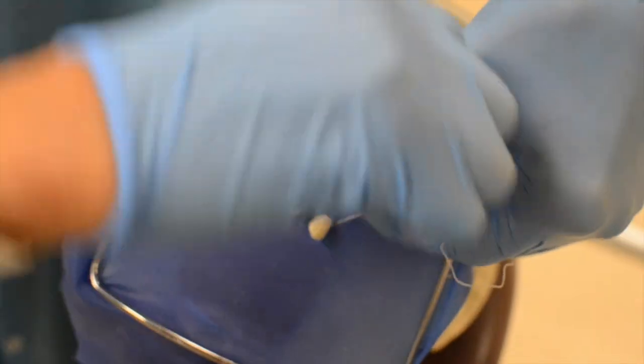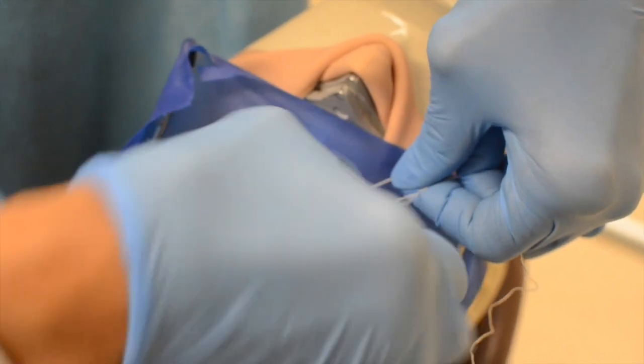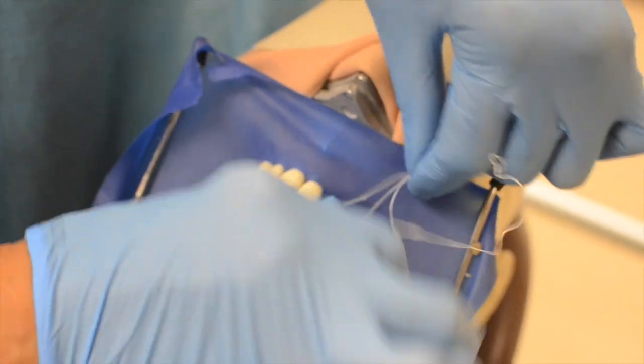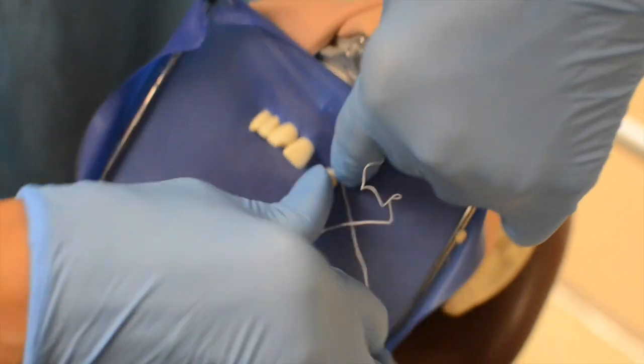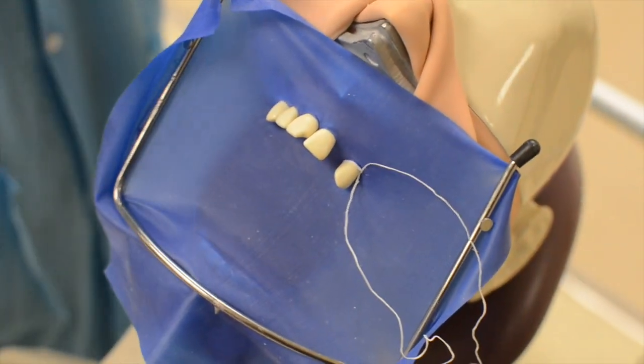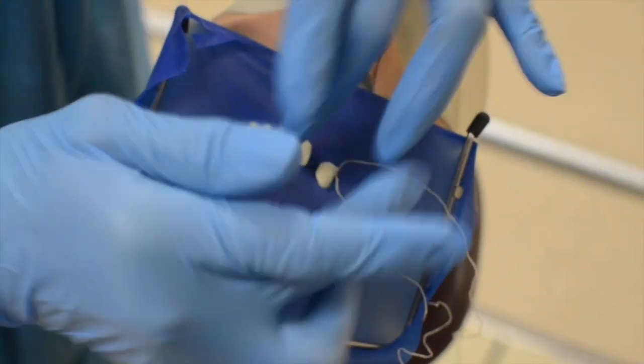You can use a piece of dental floss, and tie a knot here. Everybody knows how to make a square knot, right over left then tuck, then left over right then tuck. So that's something that you can do.